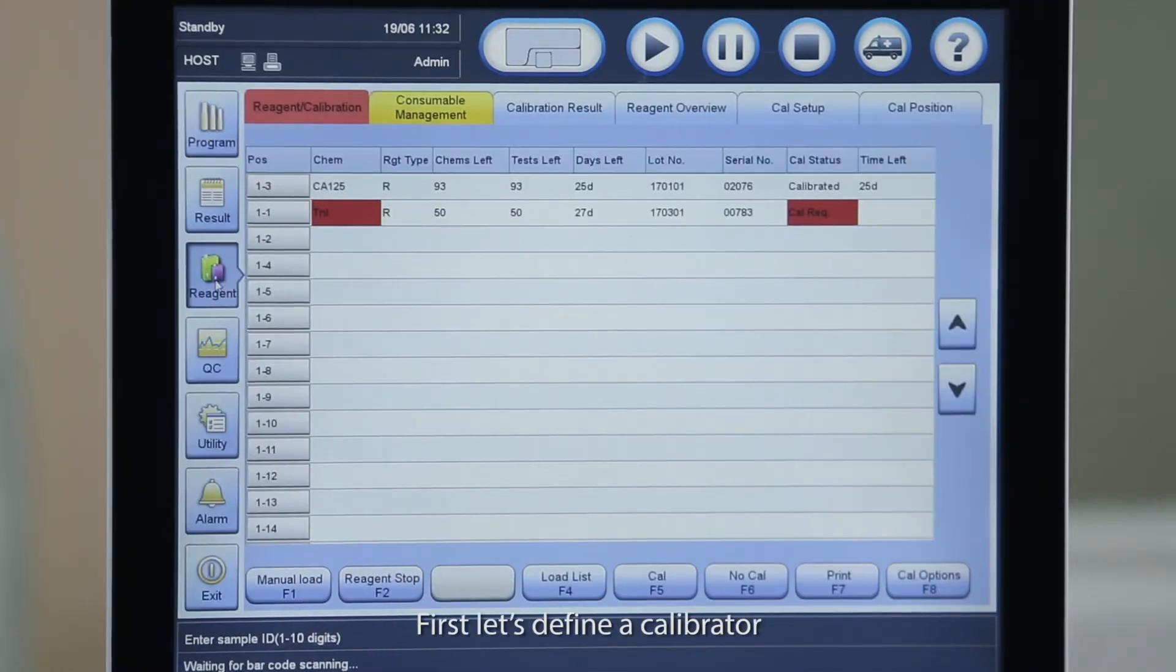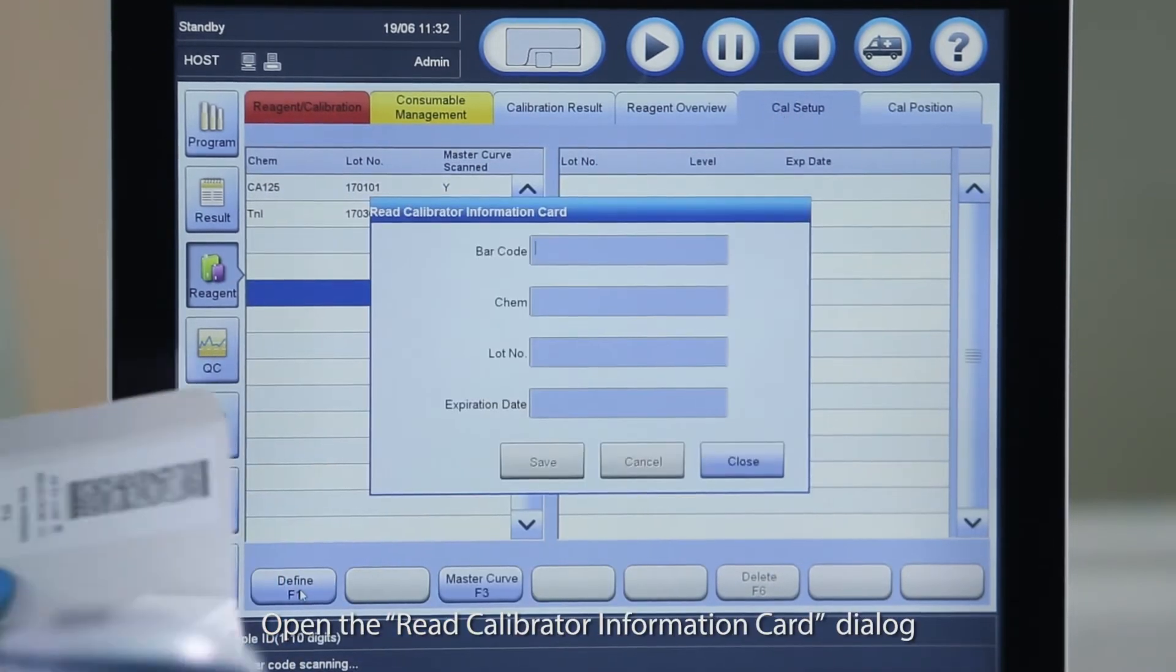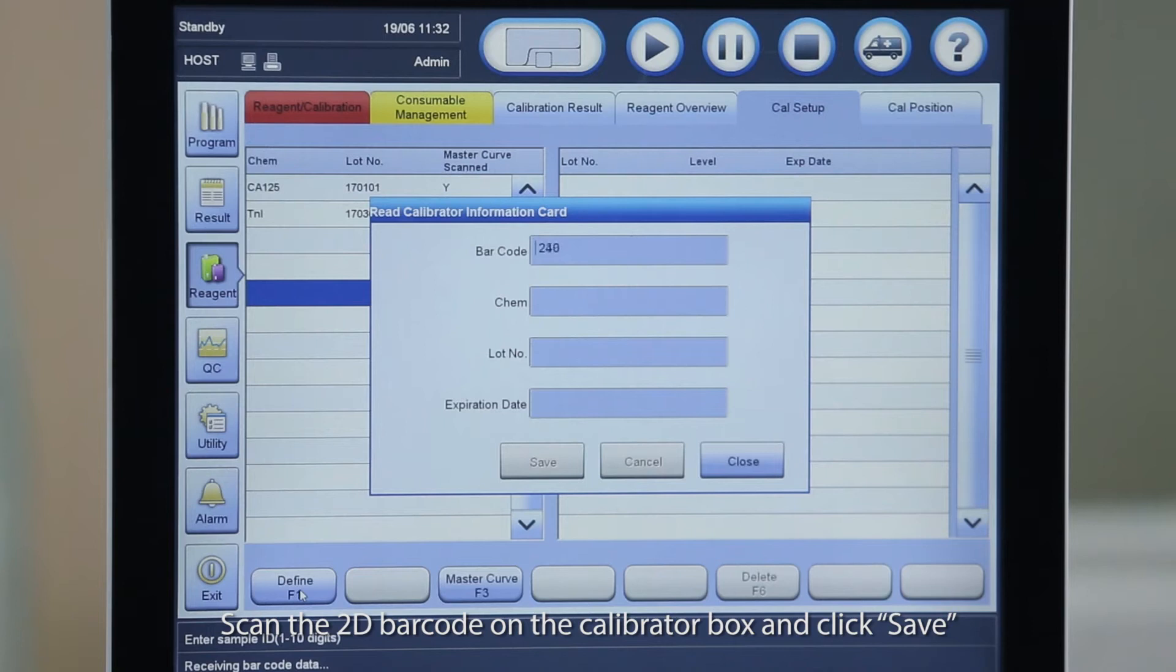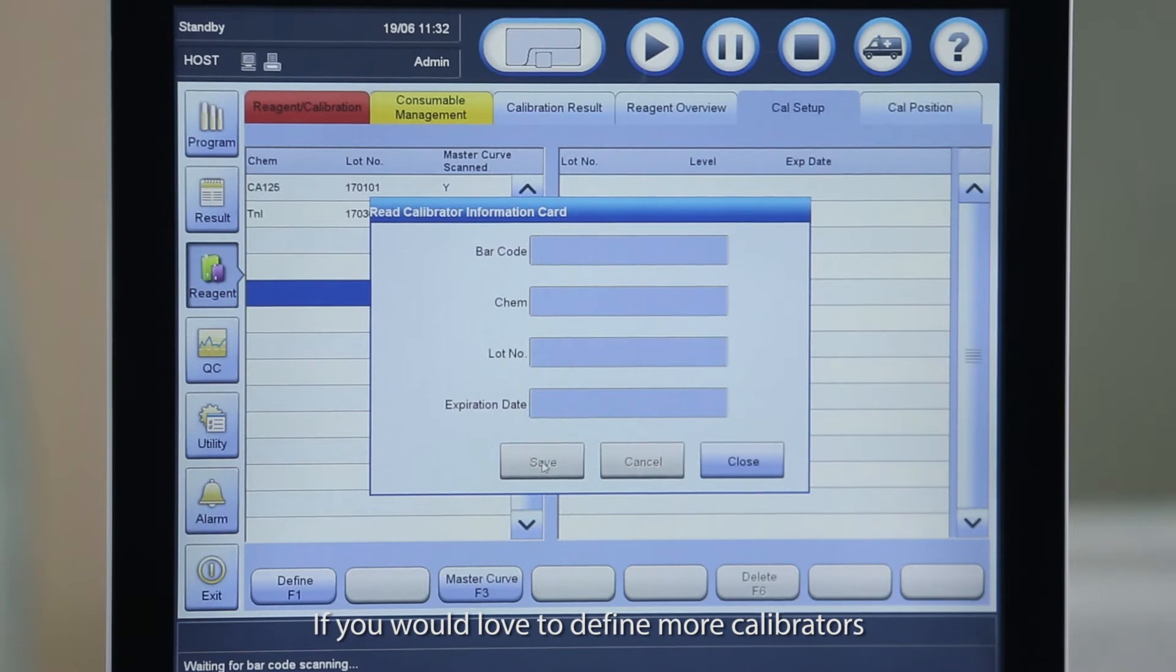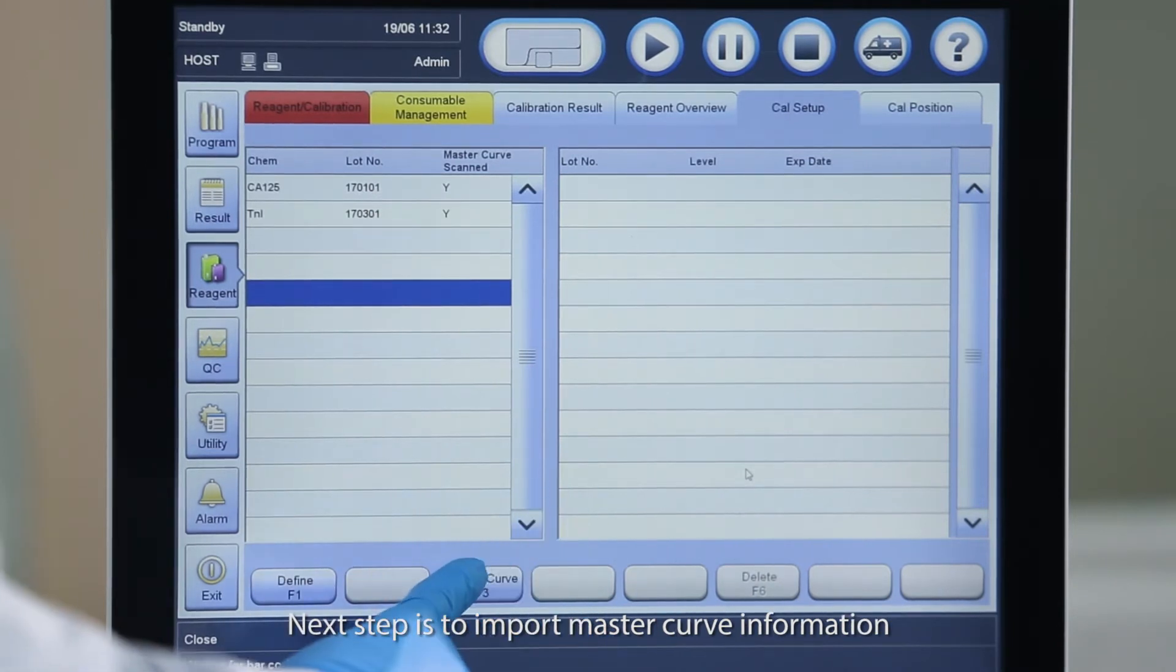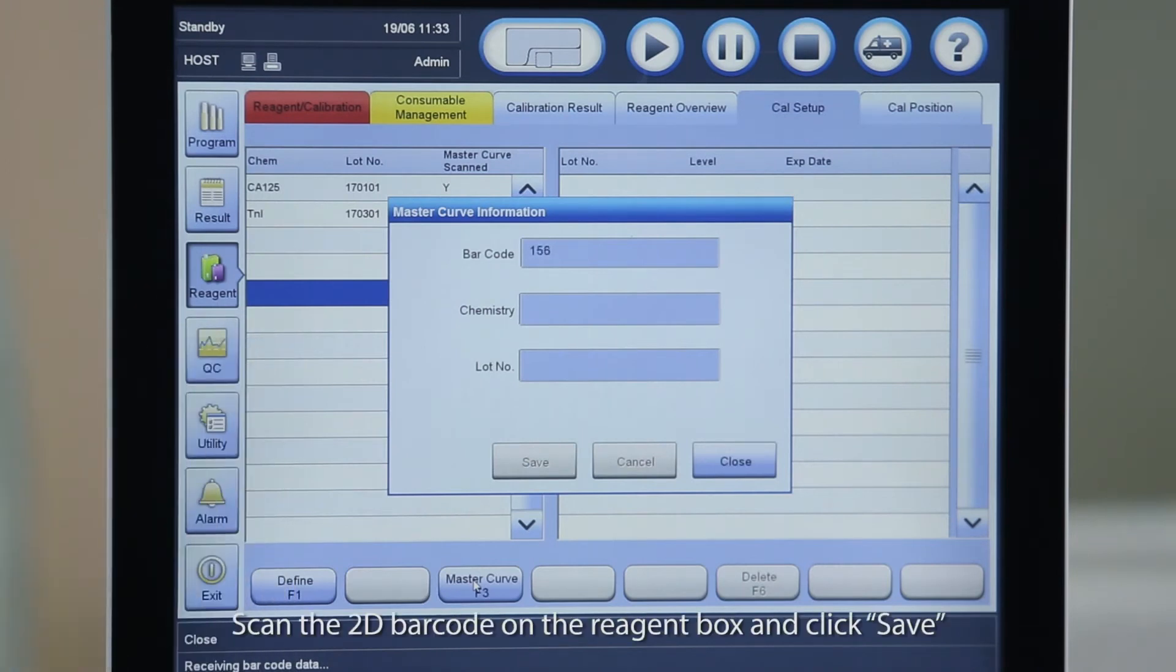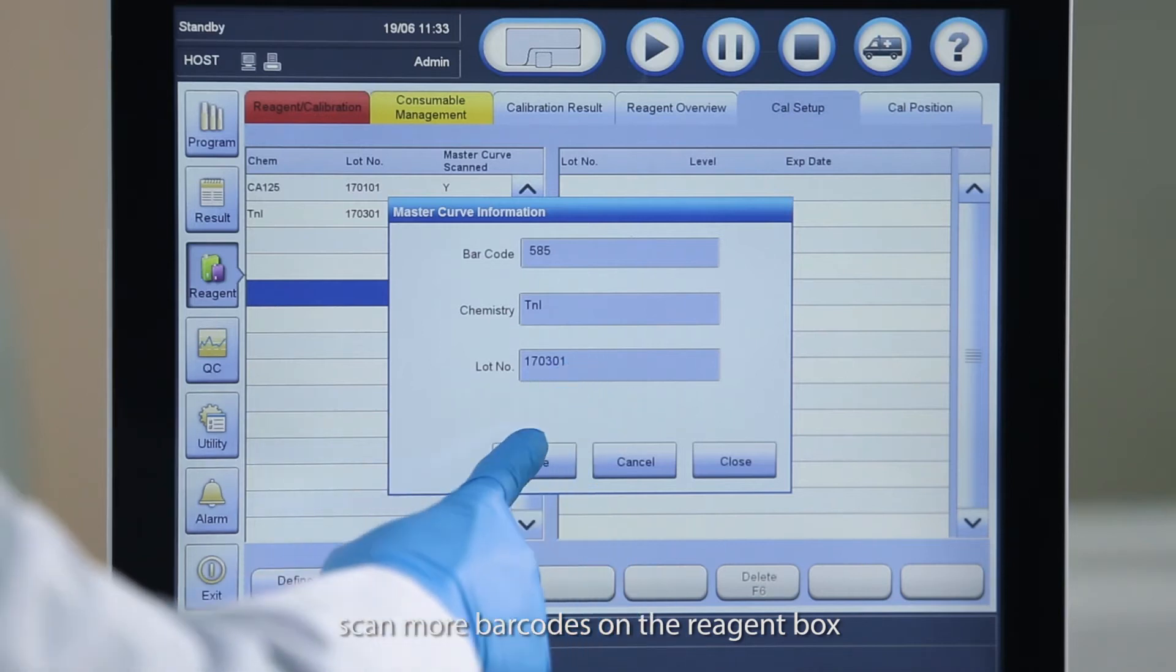First, let's define a calibrator. Open the Read Calibrator Information Card dialog. Scan the 2D barcode on the calibrator box and click Save. If you would like to define more calibrators, scan more barcodes on the calibrator box. Next step is to import master curve information. Open the Master Curve Information dialog. Scan the 2D barcode on the reagent box and click Save. To define more master curves, scan more barcodes on the reagent box.